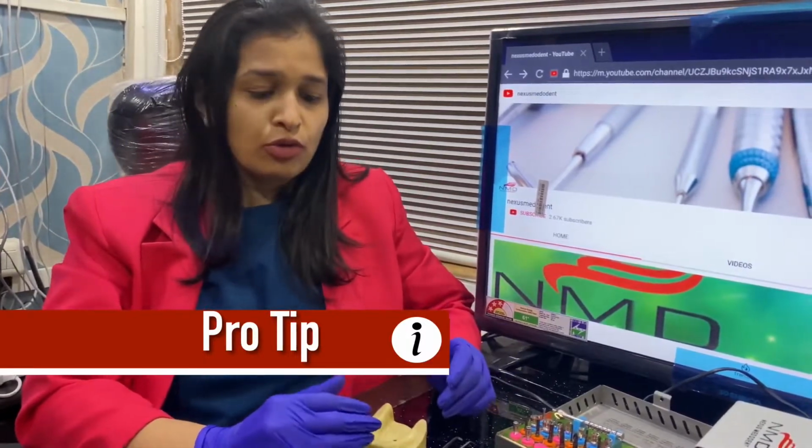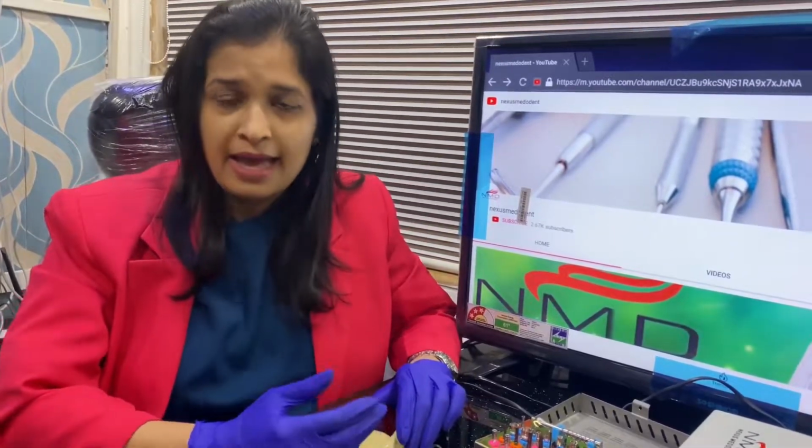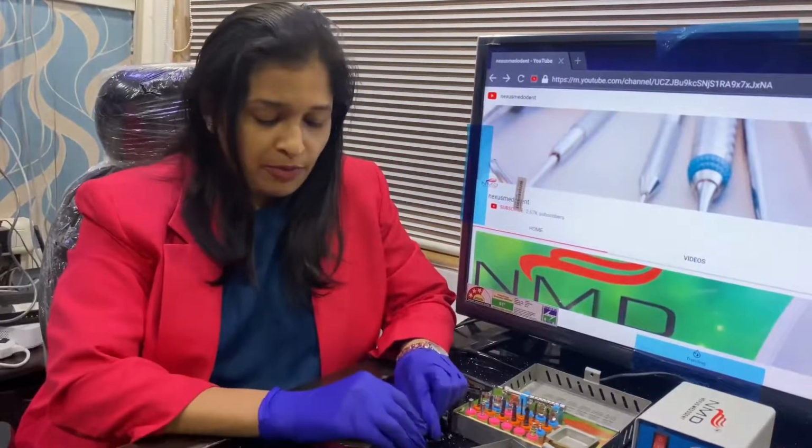So as I promised you, I'm going to leave you with a pro tip. Sometimes it can happen that in the start, if you're too scared, you tend to underdrill, and usually the implant doesn't go to the full length and the implant is stuck and you don't know what to do, and you keep torquing the implant but the implant is not going inside. What do you do in such a case? Remove the same implant, place it back into the container where you removed it from.